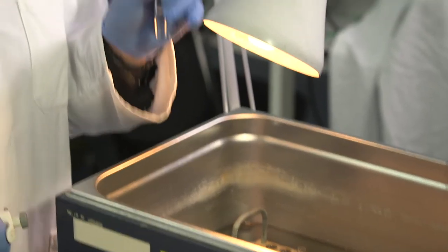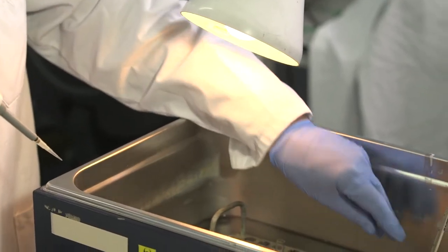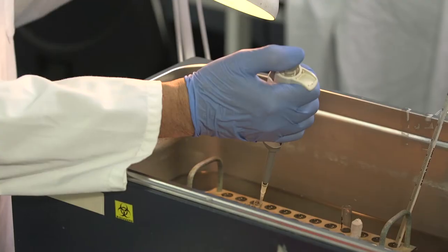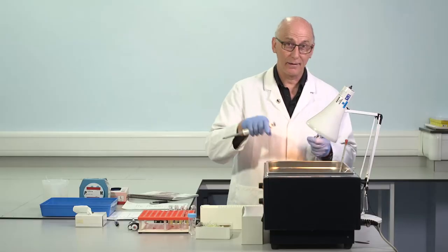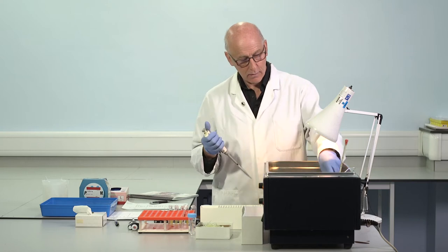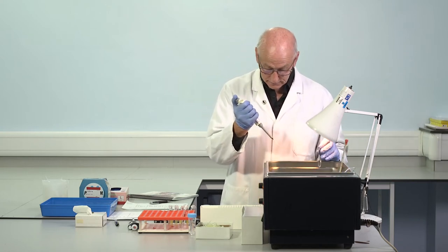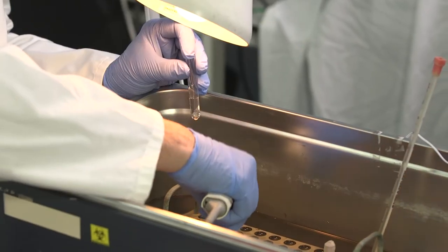So this has been warmed to 37. 0.1 of reagent. First tube. Start the stopwatch. And mix. Each addition, important to mix. APTT reagent, 0.1. The second of the duplicates, 15 seconds. And mix.